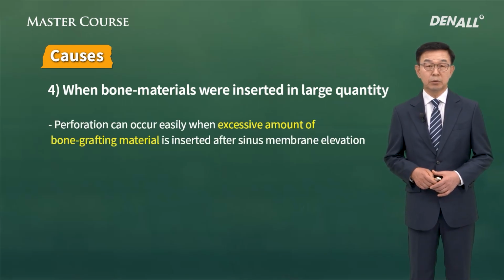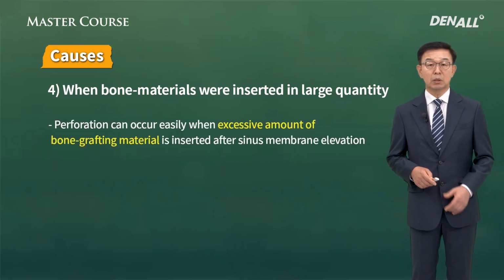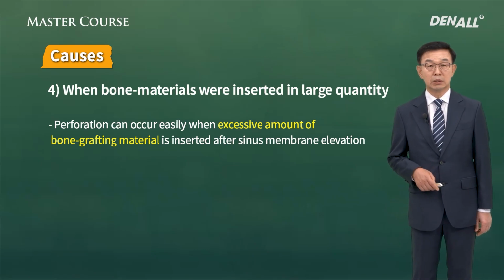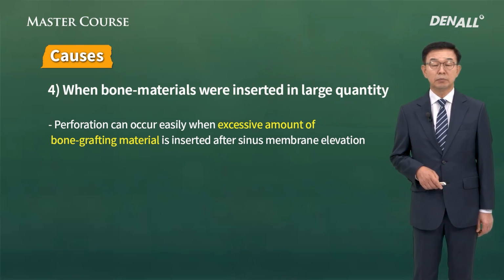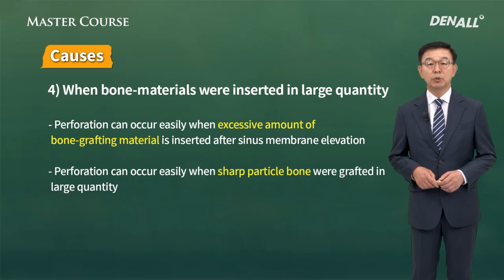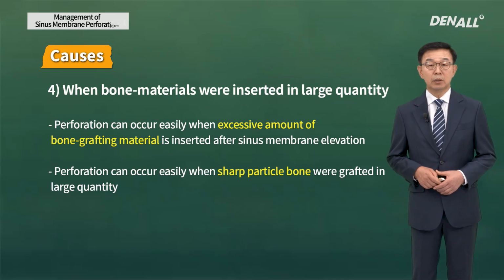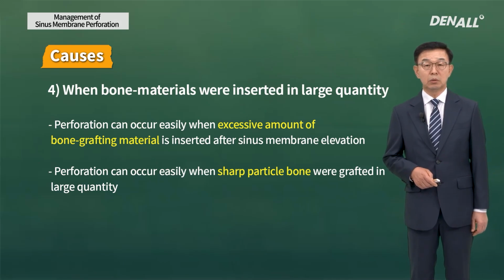This is very rare. However, when you do bone window approach and lift the sinus, sometimes too much bone graft can lead to sinus membrane perforation. Or if the bone graft material is too sharp or coarse, sinus membrane perforation during or after surgery can occur.